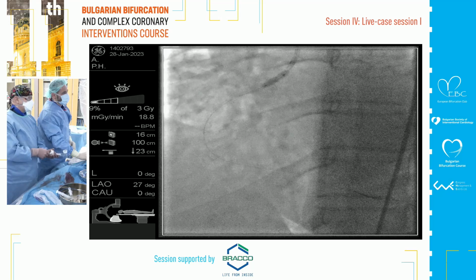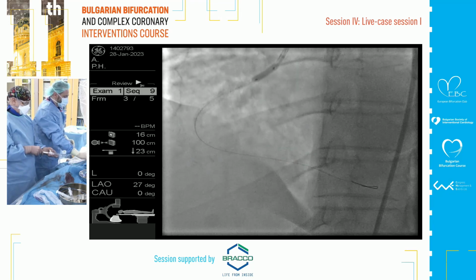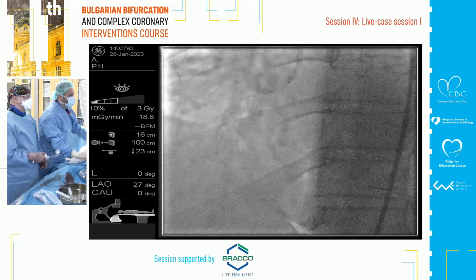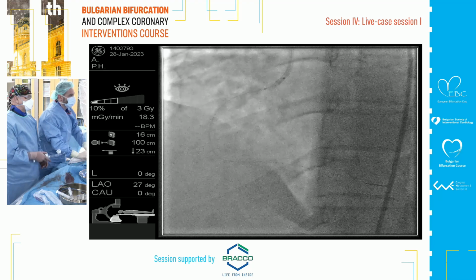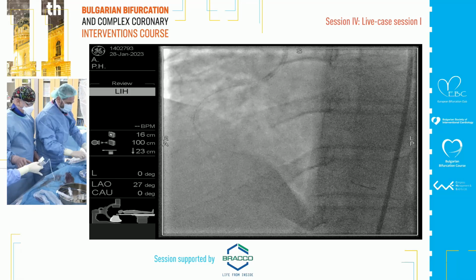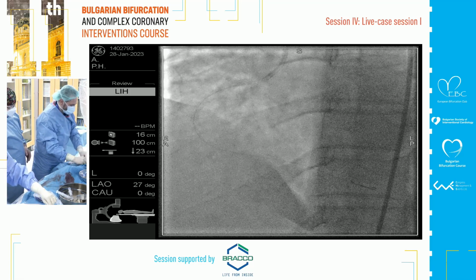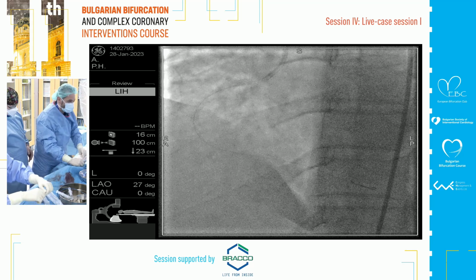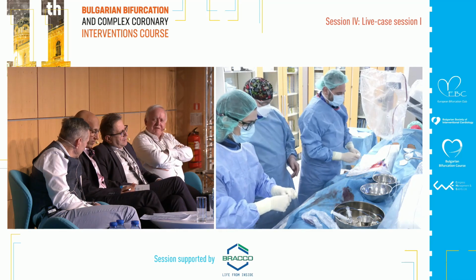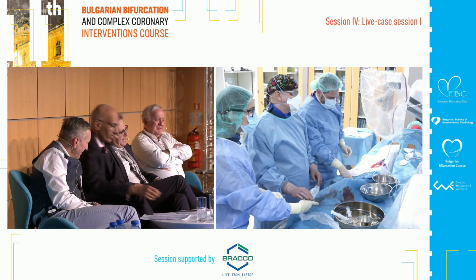Yeah. Oh, yeah. Then you can push the guide down, push the guide up. And there's almost no gap, it looks like. Maybe IVUS will show us. Watch the guide, it's going in. So what I will appreciate now is to see Akiko show us that you have a remaining proximal part of the artery which is not stented.